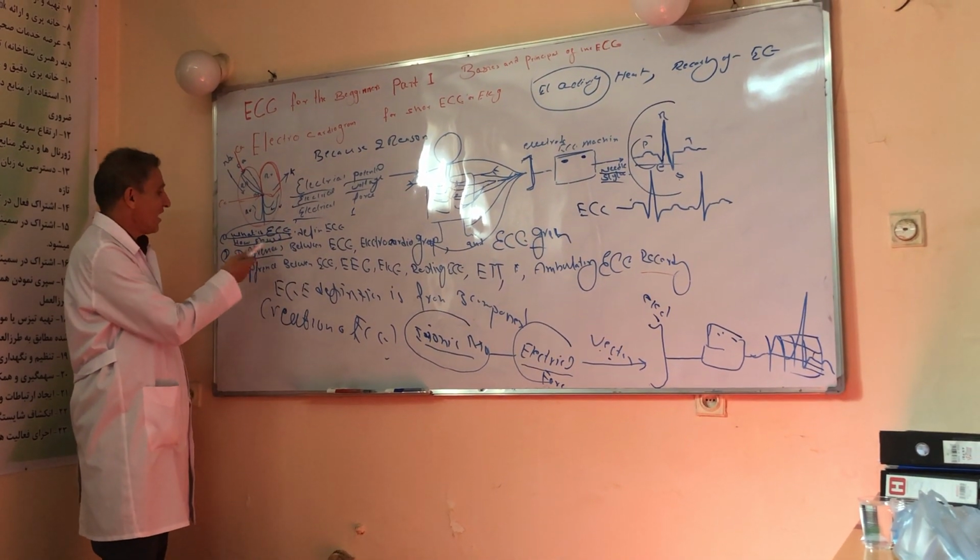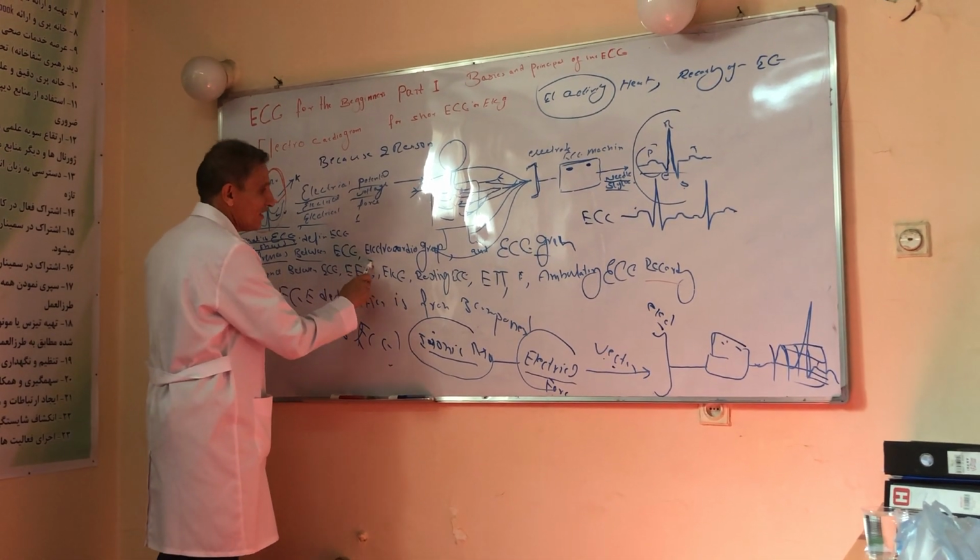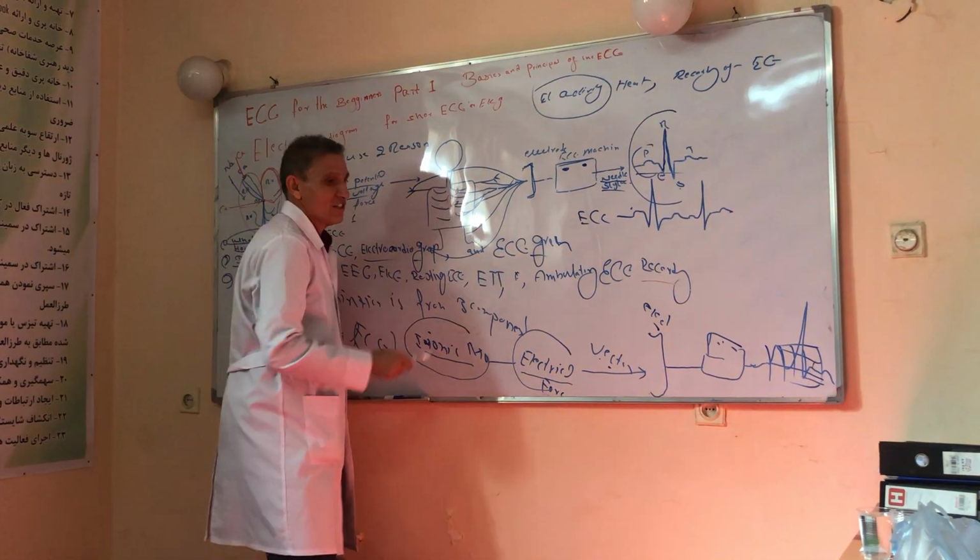What is ECG? How should I define ECG? Differences between ECG, electrocardiography, and ECG graph.